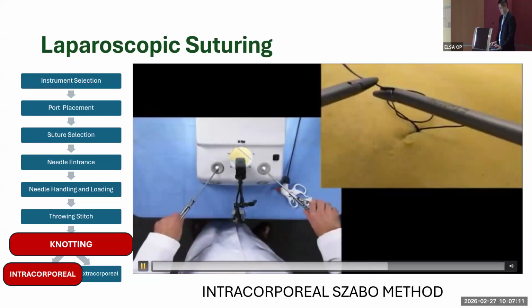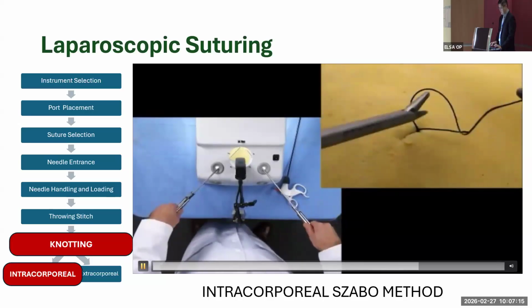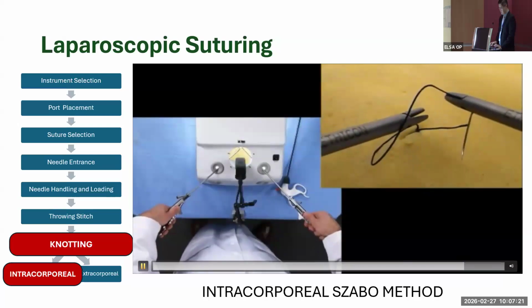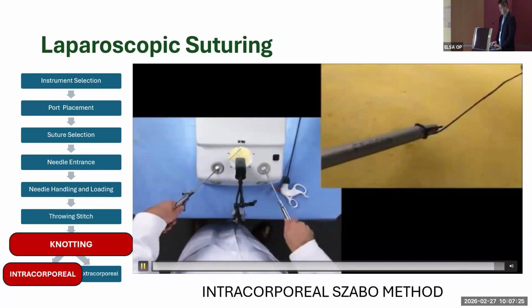We then grasp the suture with the right hand. The needle is to the right of the right-hand needle driver. The suture is coursing back at us. The needle is on top of the suture. We rotate our right hand laterally to create a camel's hump. Left hand goes over the right-hand needle driver, grasp the tag, and pull it tight.